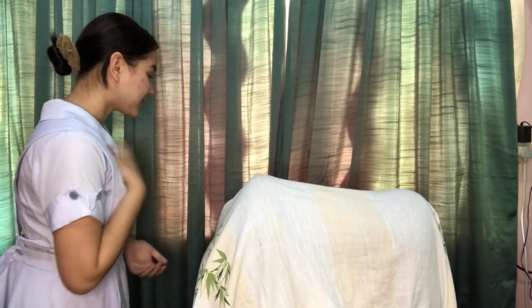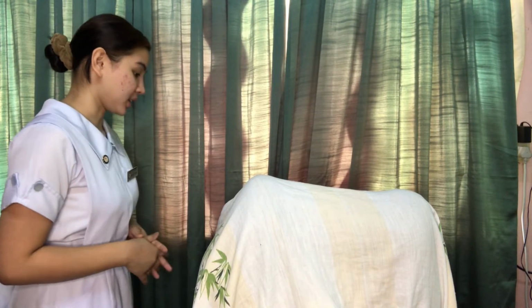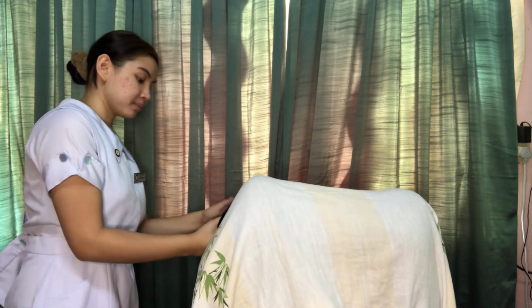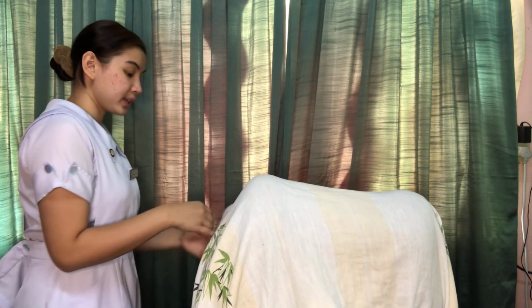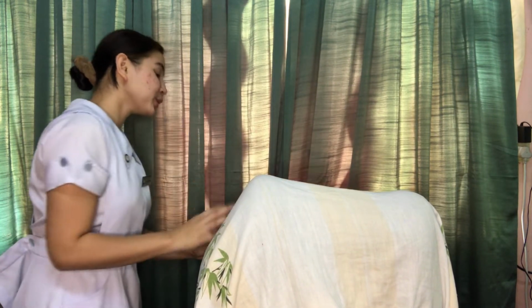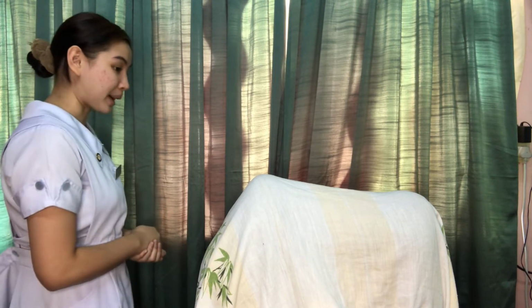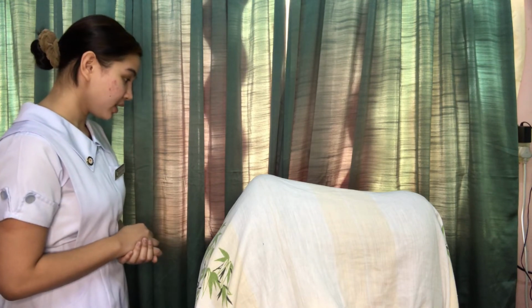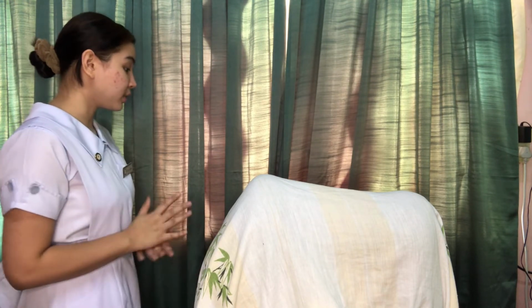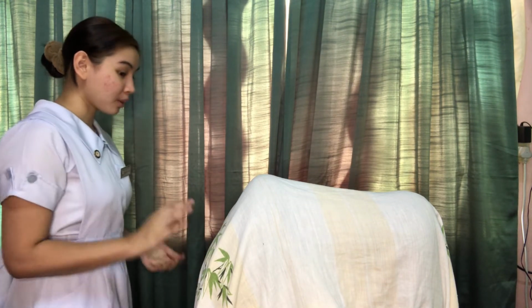Good morning ma'am, I am Lisette Ann Balagtas and I will be your nurse for today. I'm going to do the urinary catheterization. May I have your hand ma'am? And please state your name and your birthday. Okay. So how are you feeling? Are you nervous? Don't be, because I'm going to do this procedure with extra care. Urinary catheterization will help you excrete your waste, your urine. Due to some major surgeries, you cannot excrete your urine on your own. That's why we're going to do the urinary catheterization. So relax ma'am and be comfortable in your bed.